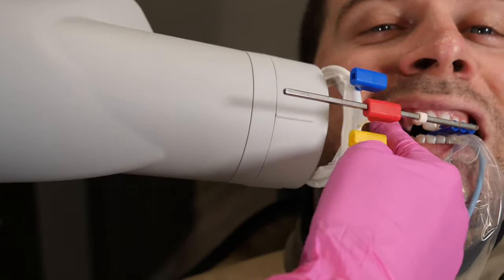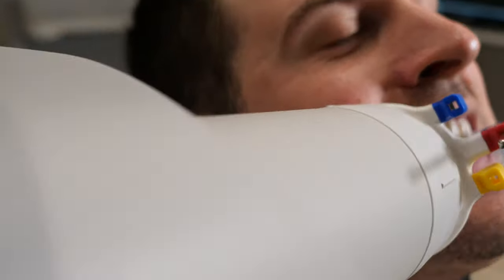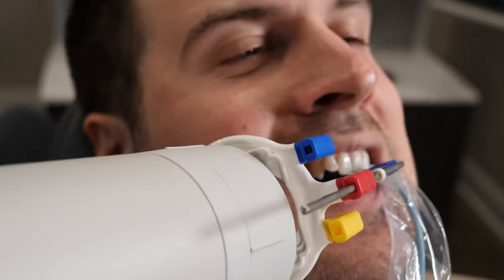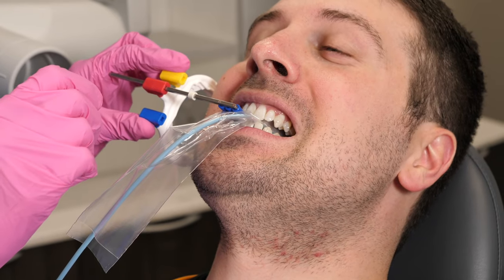Maybe with old school film, non-digital x-rays, you can line it up perfectly, but I've found it helps to not line it up — to just use it as a guide instead. Really envision the x-ray beams going through the teeth, which will help you not overlap. Asking the patient to smile so you can see their teeth helps a lot as well.